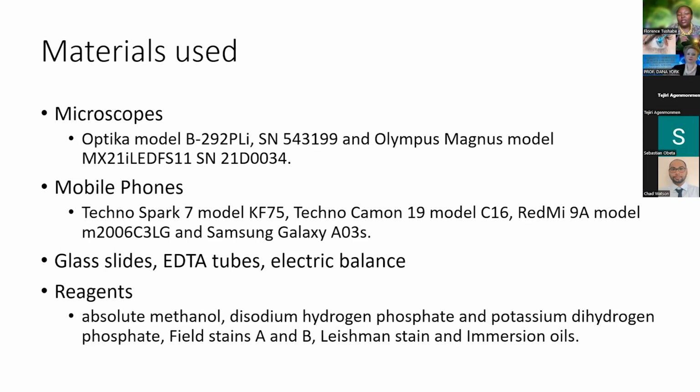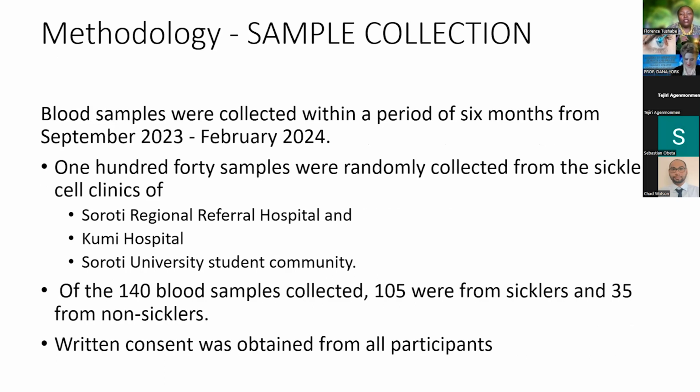So of course, we also needed glass slides, EDTA tubes, electric balance, and the reagents. Why did we need these reagents? Because we are going to process the images. So what was our methodology?